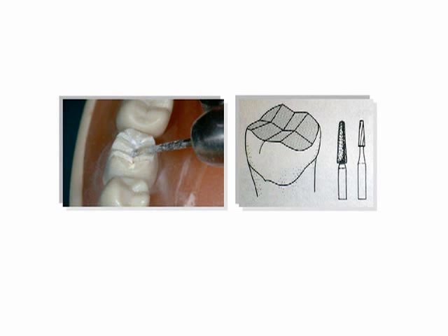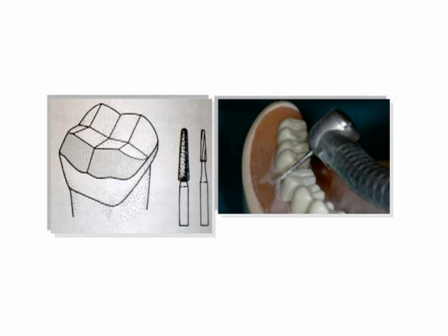Reduce the tooth anatomically. Reduction of the non-functional cusp is a minimum of 1 mm. Reduction of the functional cusp requires a minimum of 1.5 mm. Gross reduction should allow for smoothing and finishing to be performed without over-reduction. It is a good idea to reduce only one half of the tooth, to maintain the other half as a reference.